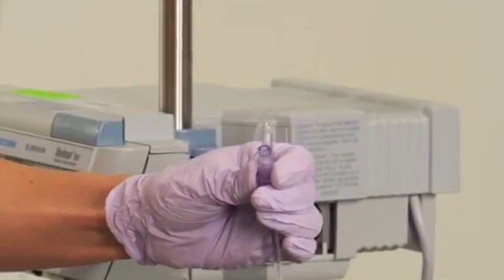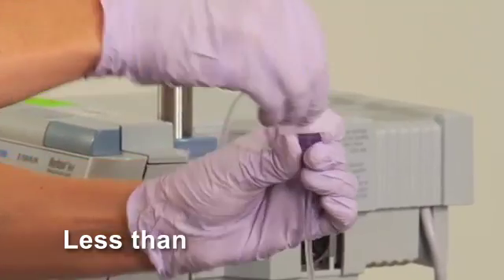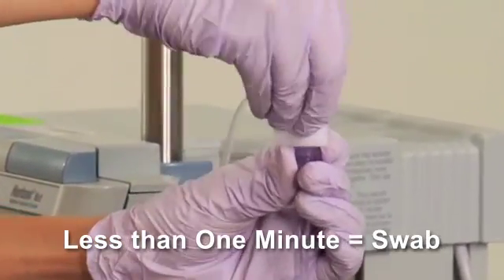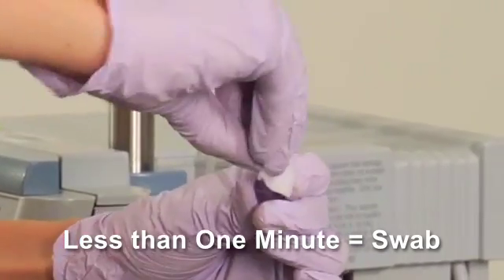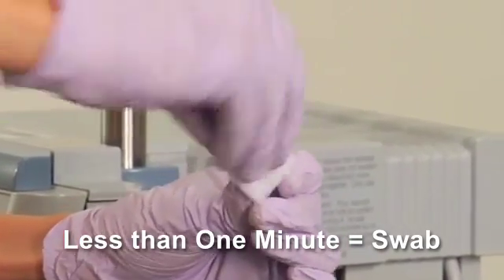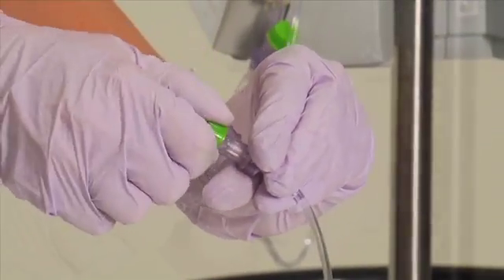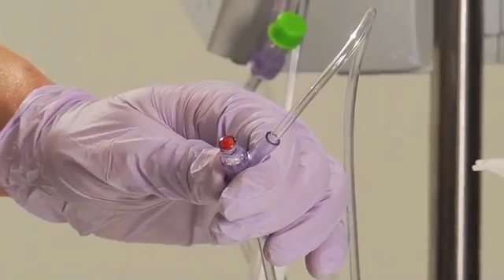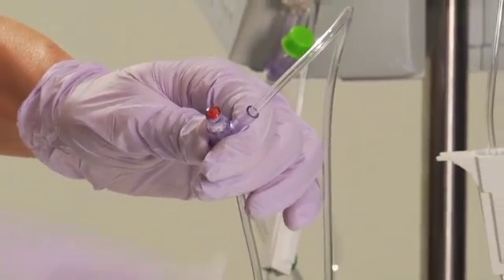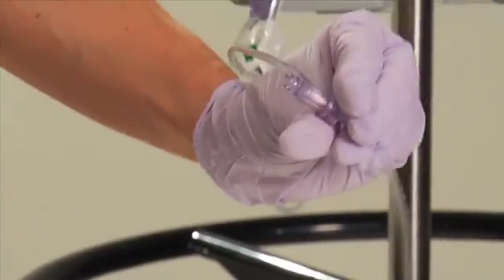If you are unsure how long the CUROS port protector has been in place, or if it has been in place for less than one minute, remove the CUROS cap and perform a swab procedure in accordance with hospital protocol before you access the needleless connector. Be sure to place a new CUROS on the connector after access to keep the needleless connector always clean.